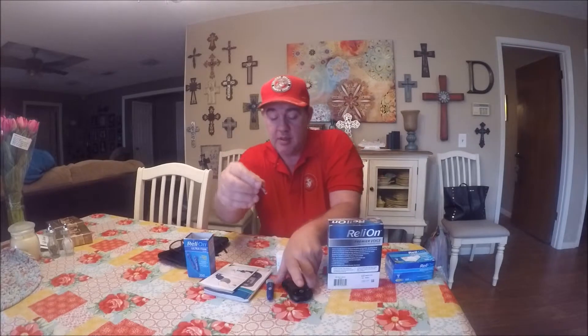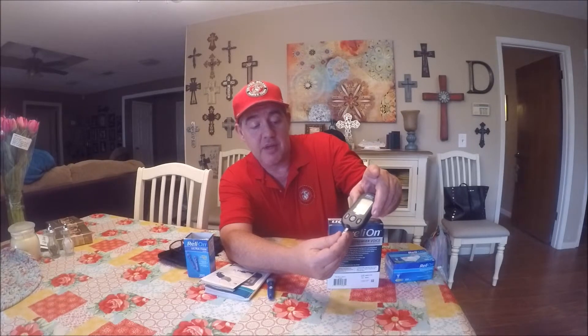I'm gonna show you — there's a little line right here. You put the test strip in right here in the bottom, and when you do it's gonna turn the machine on. You don't have to turn it on manually; when you push the strip in it will turn on and ask for blood.